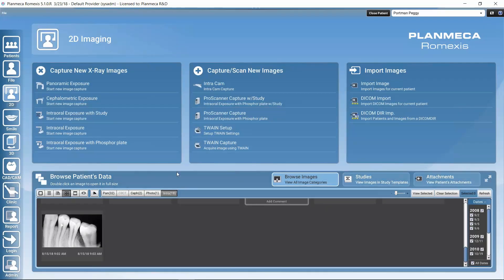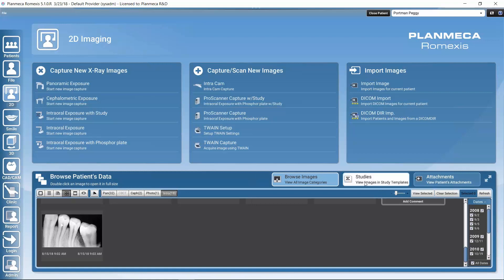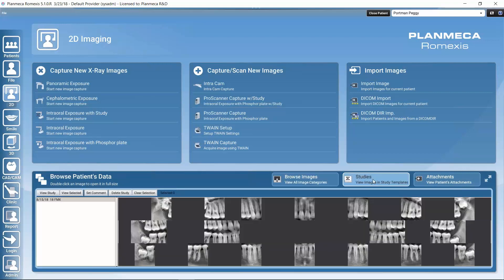Here in this image browser, we have a separate tab called Studies. This is naturally where we can find the existing studies of the patient. If we have several studies for the same patient, we would see here a list of all the ready-made studies for that patient.